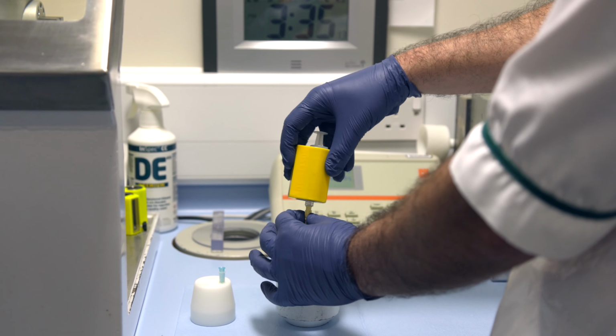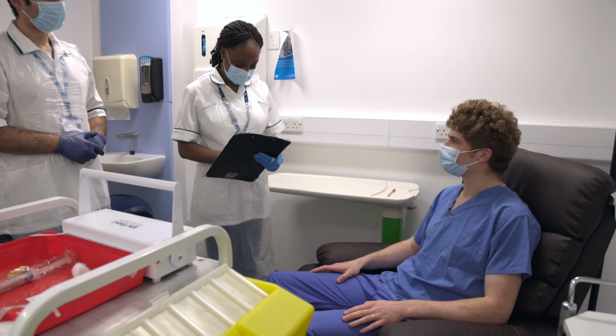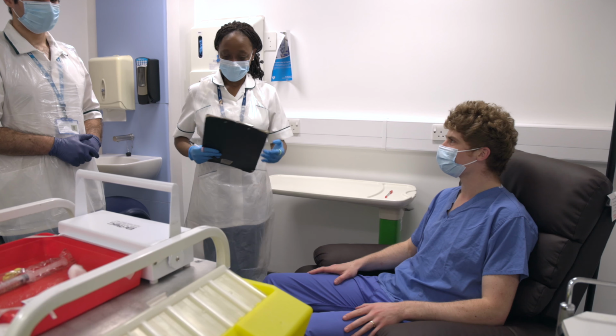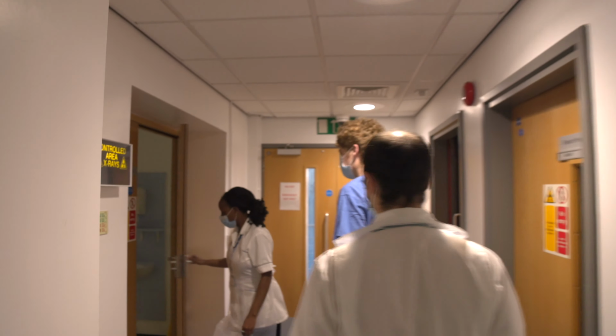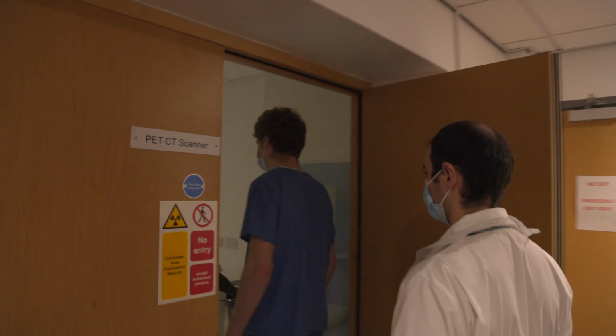When the patient arrives, the technologist will speak to them about the scan and then prepare their injection. They'll measure the right amount of radioactivity so that we get enough to get good images, but without exposing the patient to more radiation than necessary. The patient is brought to a quiet and comfortable room where the FDG is injected. They'll need to sit still for an hour while the sugar moves around and accumulates where we need it to learn about their illness. Now that the FDG has had time to move around the body, we take the patient through to the scanner to learn where it's gone.